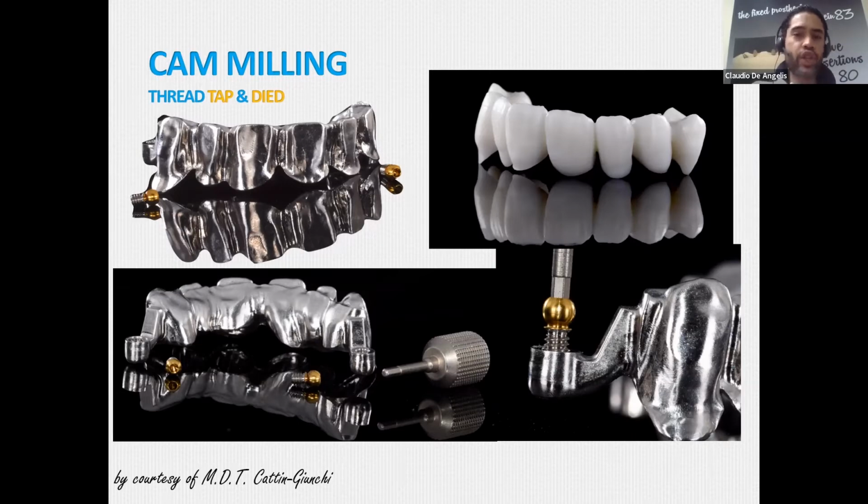So to make a check, to double check in the mouth if the work was properly designed.